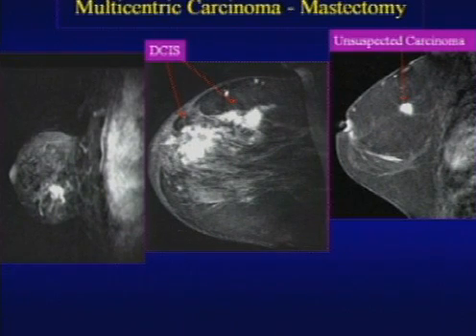However, as we continue to scan this patient, you can see more towards the center of the breast, there is this diffuse segmental clumped enhancement going towards the nipple, which is quite extensive. And in addition, in a separate quadrant, there's another smaller tumor. This is the classic spiculated rim enhancing mass.